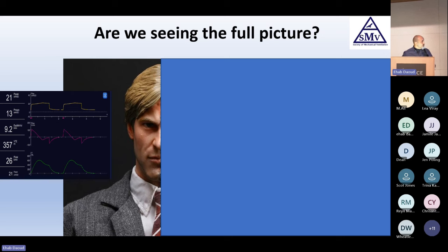what we're usually looking at during mechanical ventilation is, on the left side, the ventilator waveforms. So we see the airway pressure, the flow, the volume. And if you look at that person here, driving pressure 15, tidal volume probably less than 6 milliliters per kg. So you would think, okay, we're doing great. We're protecting that patient. We're good.